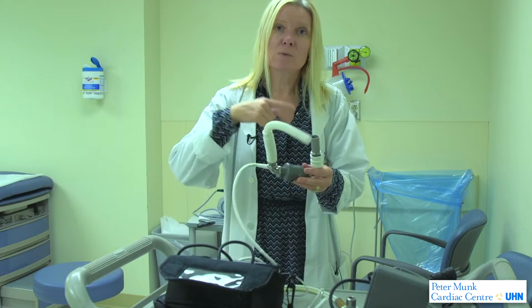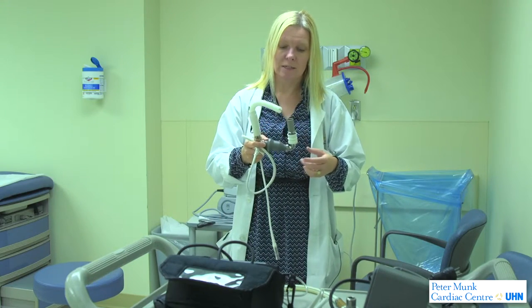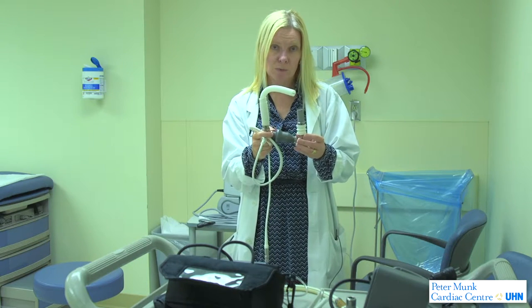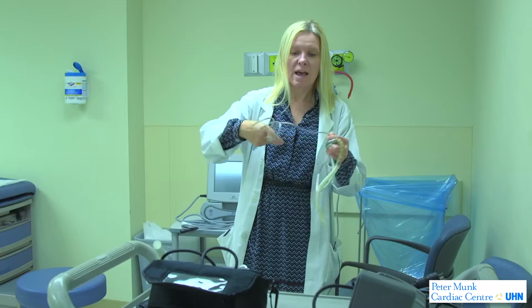Nowadays the pumps are much smaller and quieter. With these new pumps, there's a little impeller that rotates — this is called continuous flow because the blood is always being rotated. This is the HeartMate 2, which is one of the more common LVADs that we implant now.